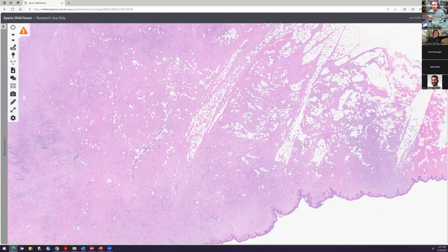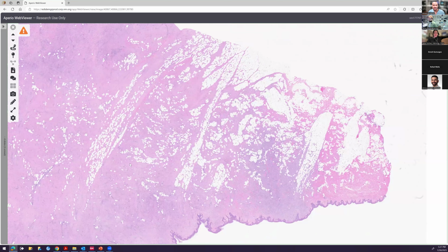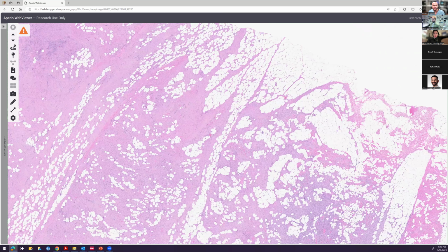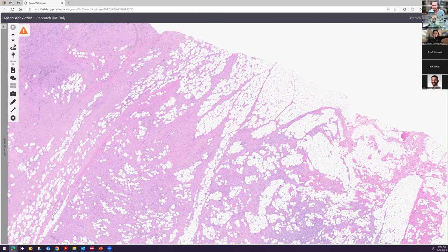Yeah, it looks like an infiltrative lesion. Yeah, it's infiltrative. That's true. It's most of it. This whole slide is lesion, but you can see it's infiltrative. Okay, what do you think about the infiltration? Yeah, it's infiltrating into the fat, and then it seems like there are some areas of fat that are entrapped within the tumor. Yeah, that's true. You've got some entrapped fat. Okay, all right. If you look at how it's going in between the fat, that's also important for this case. But just keep that in mind for now, and we'll come back to that.